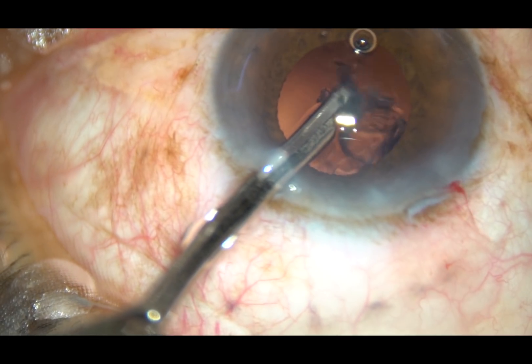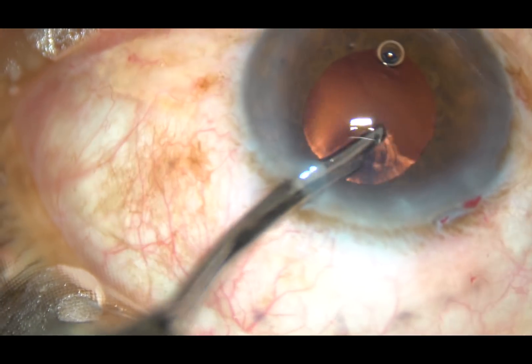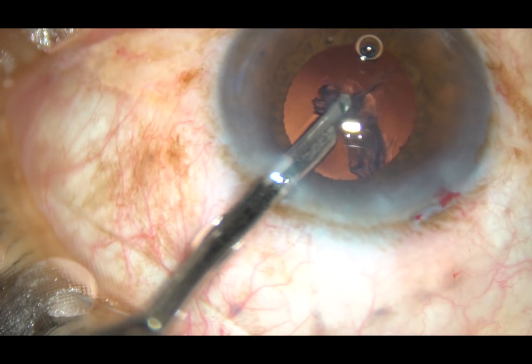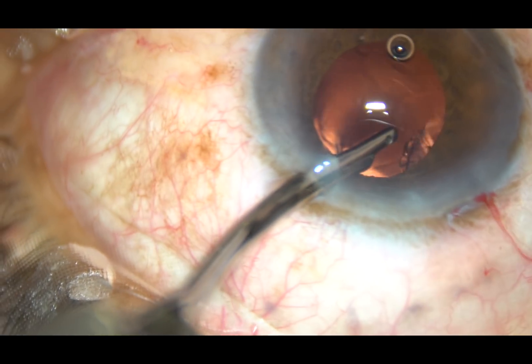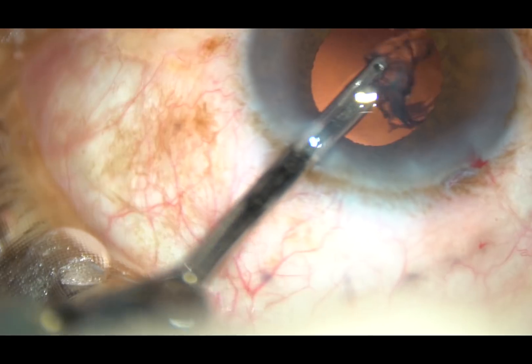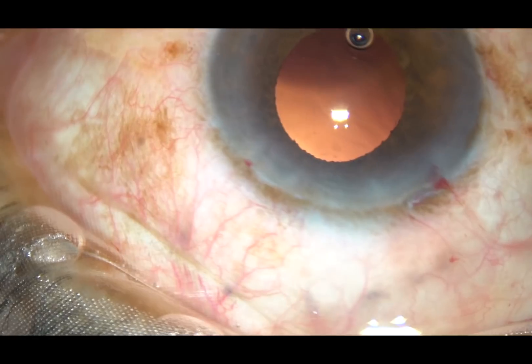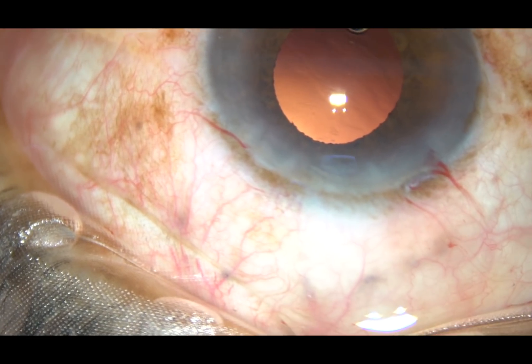Cortical cleanup in this case is being done with the help of a 23-gauge Simcoe cannula, because there is only one side port. That's it — the cortical matter has been removed.